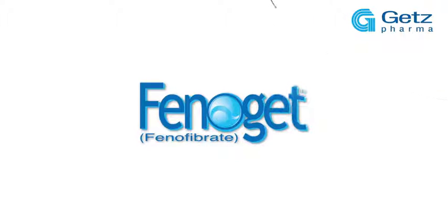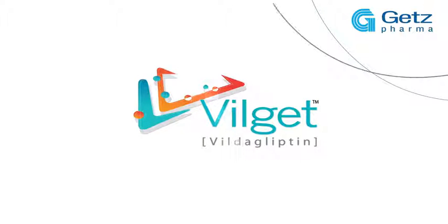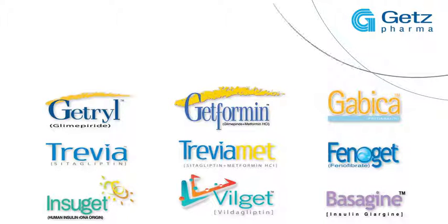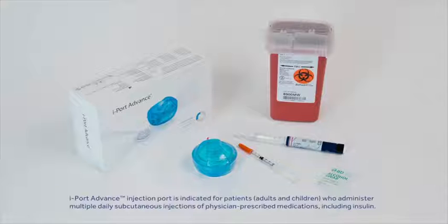Thank you for joining us. In this video, you'll receive step-by-step instructions on how to apply, use, and remove iPort Advance.